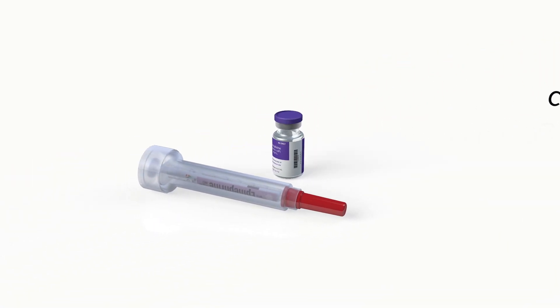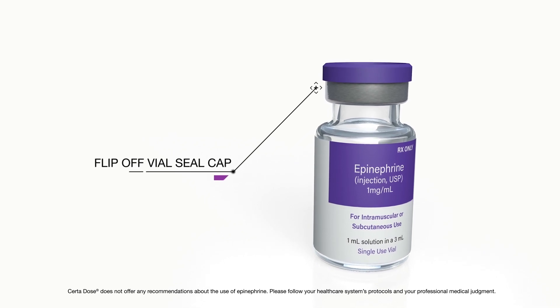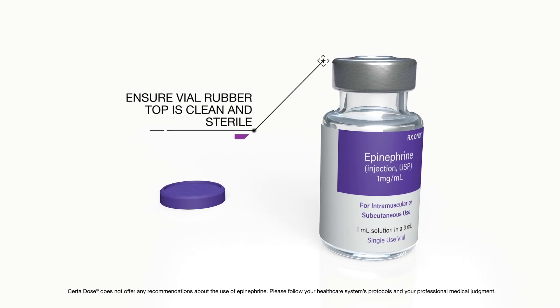The Sertidose Epinephrine Convenience Kit for Anaphylaxis. Flip off the vial seal cap. Ensure the vial rubber top is clean and sterile.